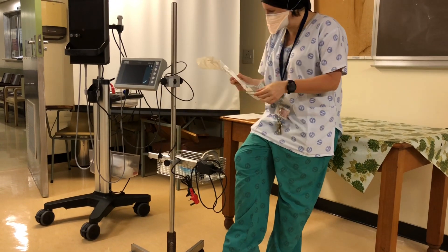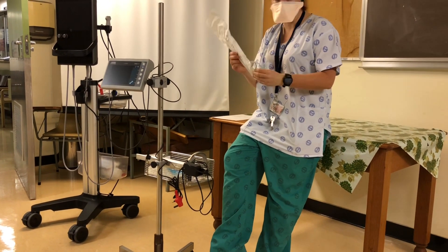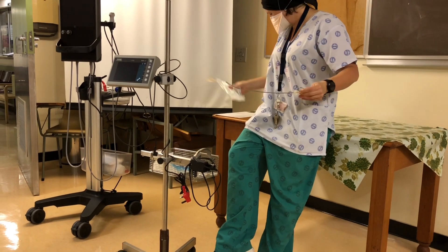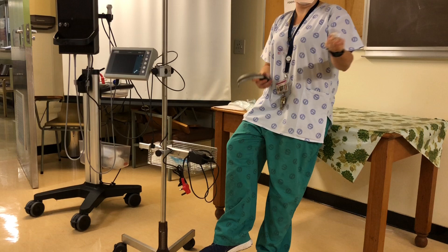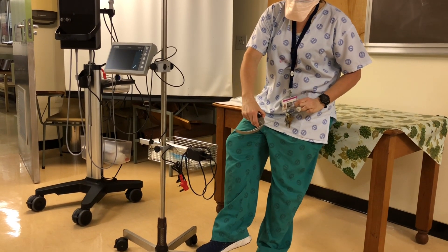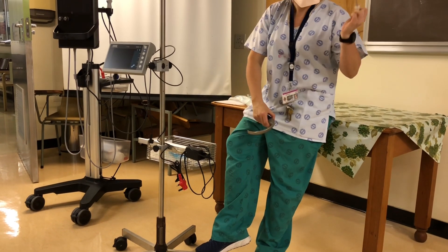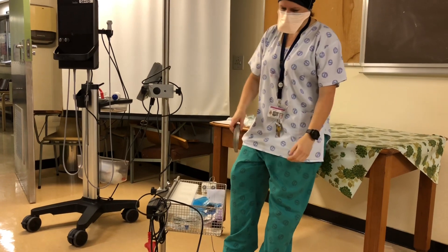There's also this C-Mac guide — I see this one has been bent — specifically for the blade. It's supposed to be for the curvature of the blade to make intubation easier. I see somebody used the basic stylet instead. We'll have to replace this. This is reusable and goes in there.